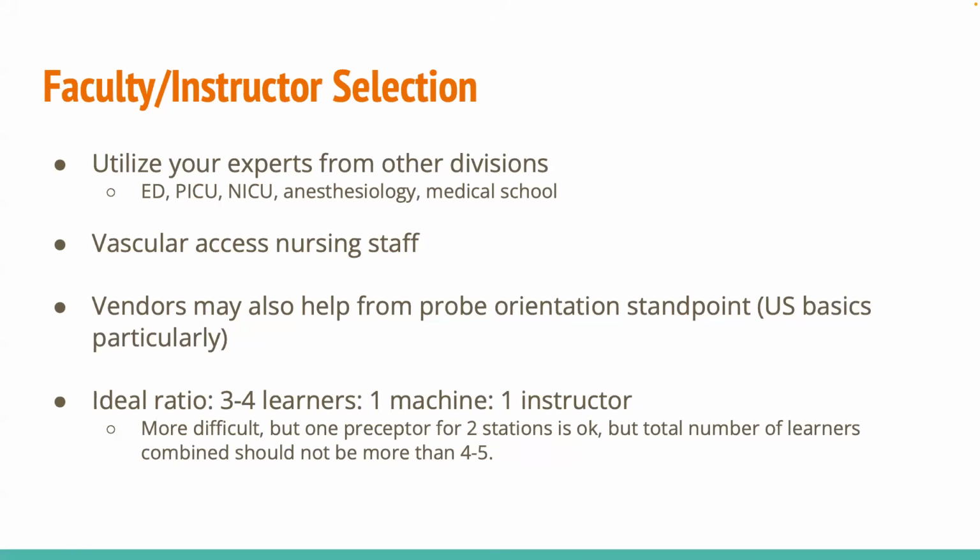The same with your vascular access nursing staff. Every year our VAT, our vascular access nurses, come and help, even if it's not for ultrasound assisted, even if it's not for PIV. They're very helpful in terms of, well, you should turn your gain down on this or turn it up on that, and are very good with the knobology stuff.